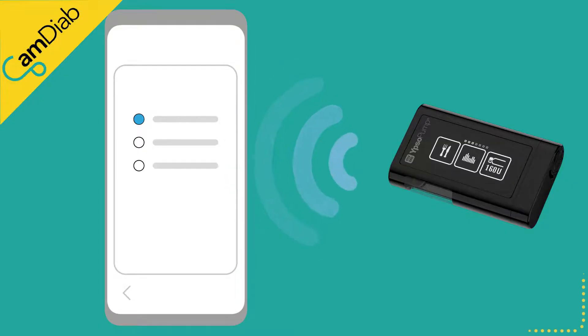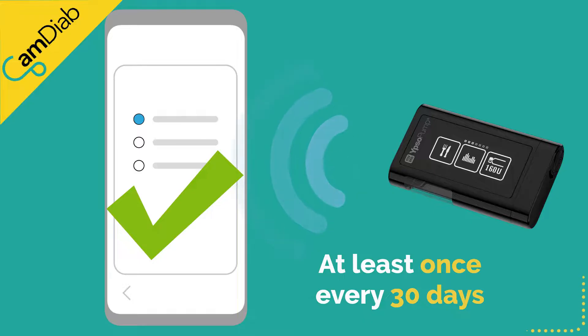You will need to be connected to the internet at least once every 30 days to maintain the pump pairing with the MyLifeCam APS-FX app. This is for cybersecurity reasons.